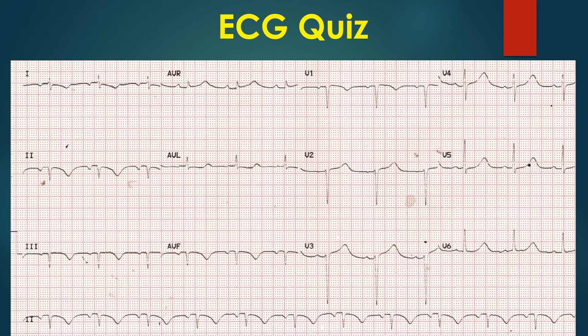Coming back to the initial observations, what looks like an inferior wall myocardial infarction with a rhythm other than sinus rhythm with an abnormal P-wave axis can occur when the right arm and left leg leads are reversed while recording the ECG. The simplest way to check for lead errors is to take a repeat ECG under direct observation and compare the tracings. In this case, the inferior wall infarction pattern and abnormal P-wave axis reverted in the repeat ECG.